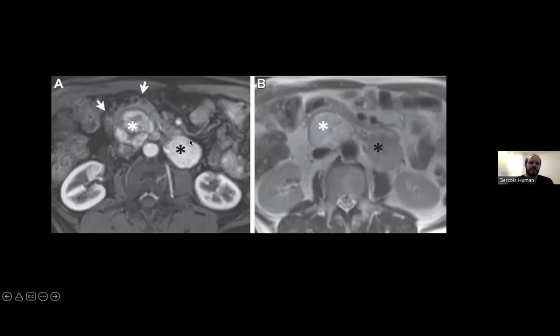In addition, the patient also has this very homogeneously enhancing mass situated just inferior to the pancreatic tail. This was the T2 image, and the brighter areas inside were described as light bulb bright. As you can imagine, it's not as white as this asterisk, so that's why they say how bright is a light bulb exactly. One can see these pancreatic paragangliomas quite well circumscribed in the retroperitoneum.